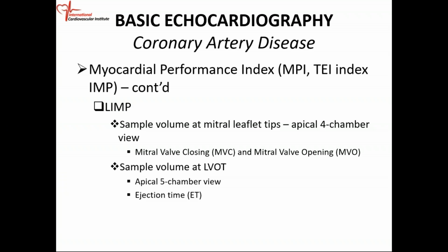You're going to subtract from that the ejection period or ejection time, and you're going to divide by the ejection time. Okay, so you need your apical 5-chamber view, and let me just show you exactly.